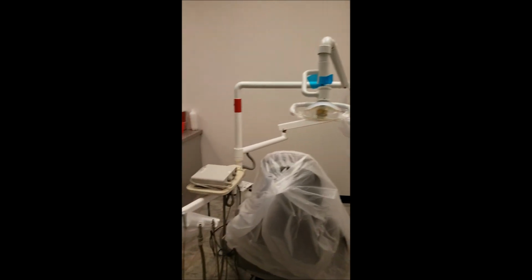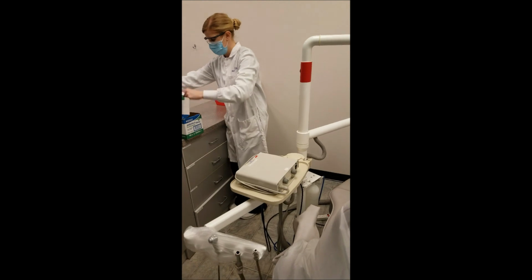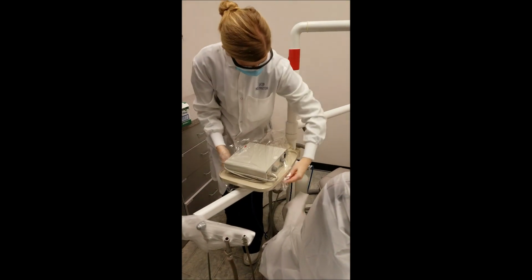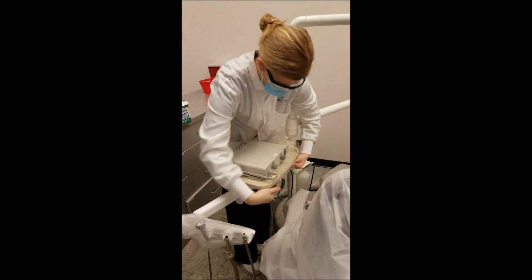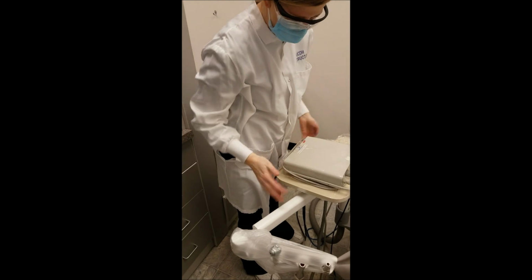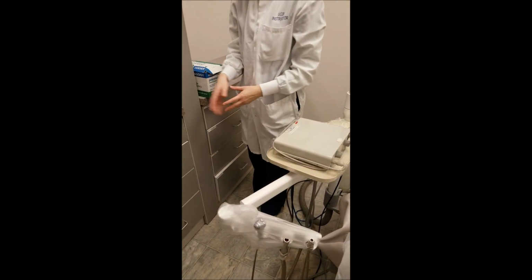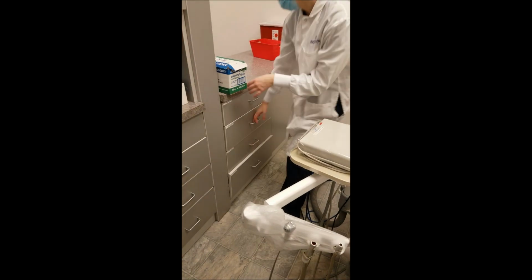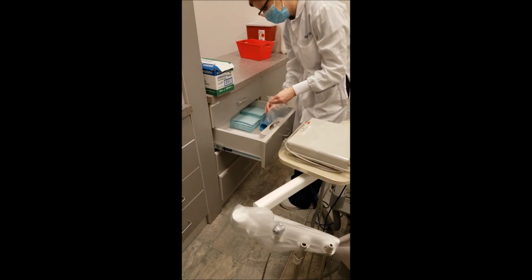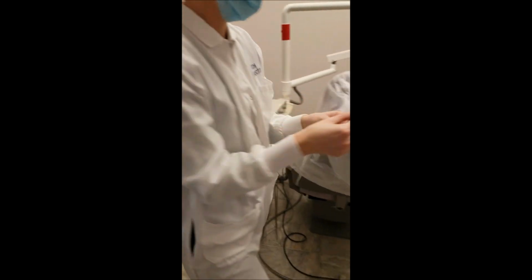Good, and then the ultrasonic will barrier that as well. Give yourself a master wrap to completely cover what the ultrasonic is sitting on, and all of your cords. Okay, and then we will grab barriers for the high volume evacuator, the saliva ejector tubing holder, the ultrasonic, and the air water syringe handles.